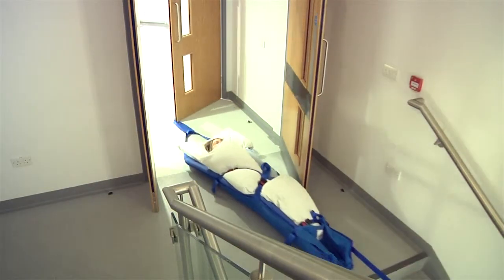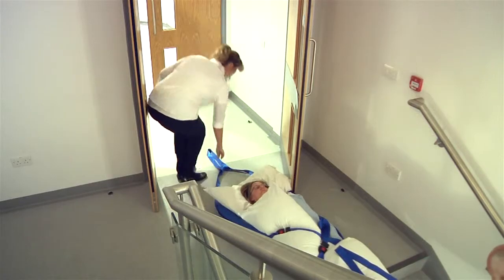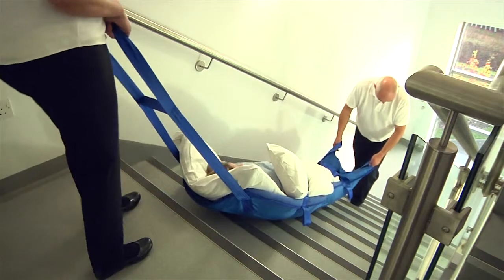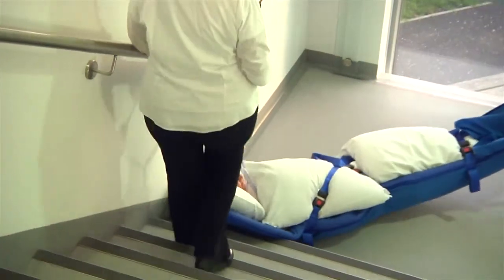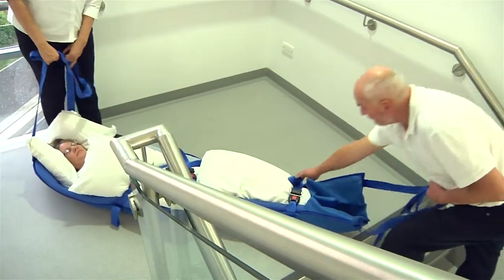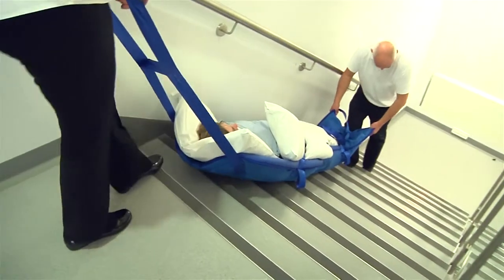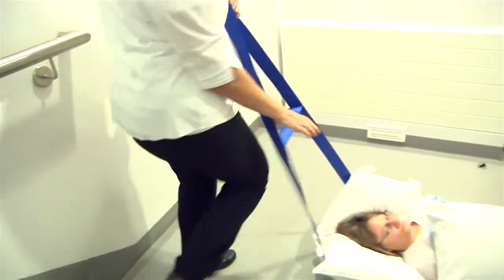With one person at each end of the ski sled, the patient can be negotiated down the stairs. The operator at the head end should keep the pulling strap long and assist by slightly raising the handle as the body moves over the top step. It is very important that the person at the foot end keeps the pulling strap short until the upper part of the body has come over the top step — this helps to prevent excessive bending of the patient's hip and pelvic area. When reaching the half landing, steer a wide course so you do not encounter problems with the central pillar of the staircase. If needed, the cross straps can be used to position the ski sled on the half landing area. Good communication is essential to ensure that the head end operator does not overbalance in an attempt to keep pace with the carer at the lower end.